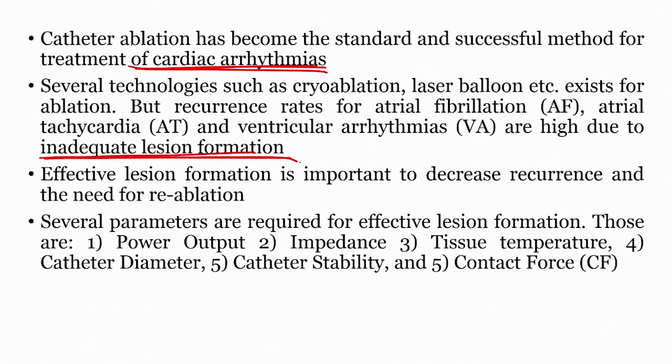If the lesion is not formed properly, then the burning of that particular region is not done correctly, and the recurrence would be higher. So, effective lesion formation is important to decrease recurrence and the need for reablation.